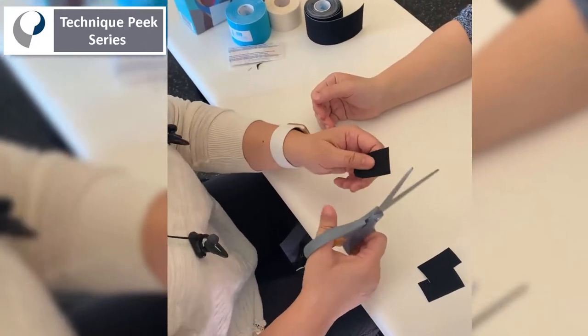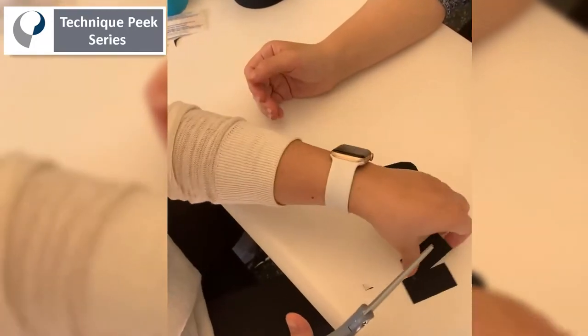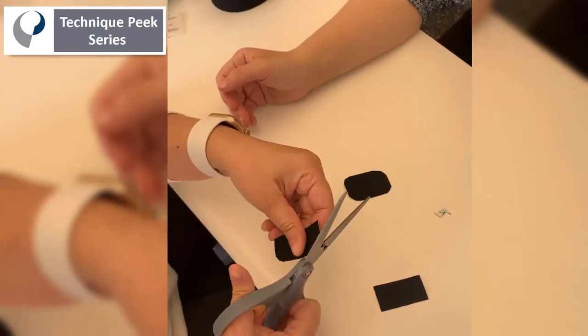This is a taping method for de Quervain's tenosynovitis — it's a kinesio taping method. It's not only a taping method for de Quervain's, but it also includes tricks and tips on how to keep the tape on a little bit longer than most.